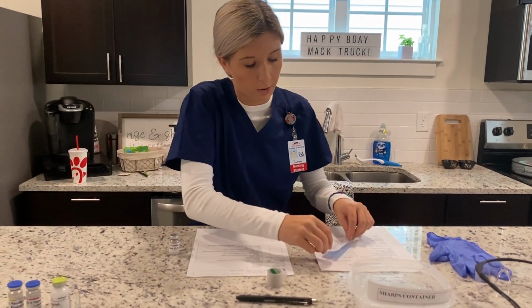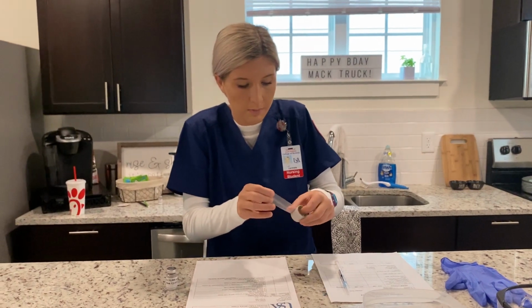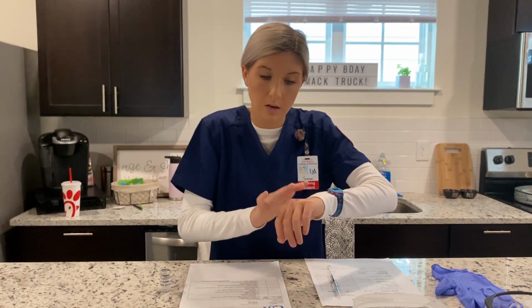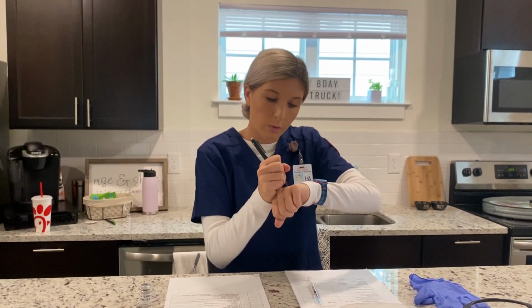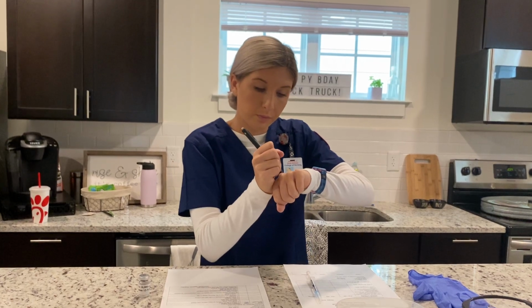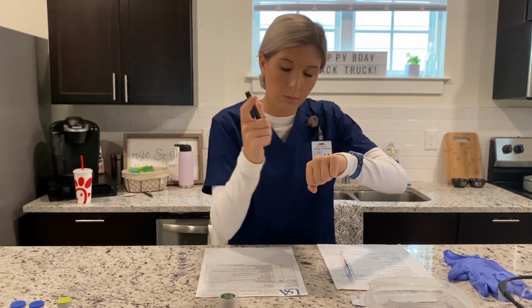But before I do that, I'm going to make a label for the syringe. So I'm going to take a piece of tape and I'm going to write the patient's name, Jaguar Jones, the drug, heparin, the dose, 5,000 units, and I'm gonna initial it.